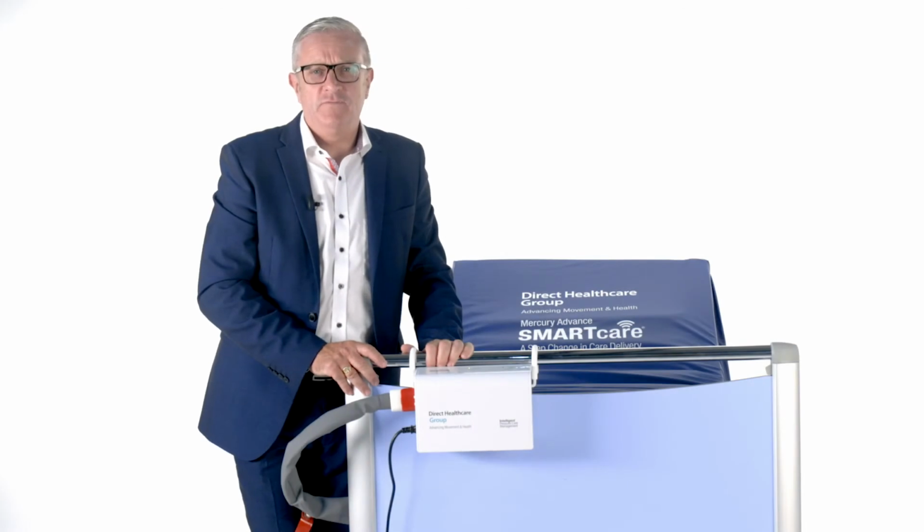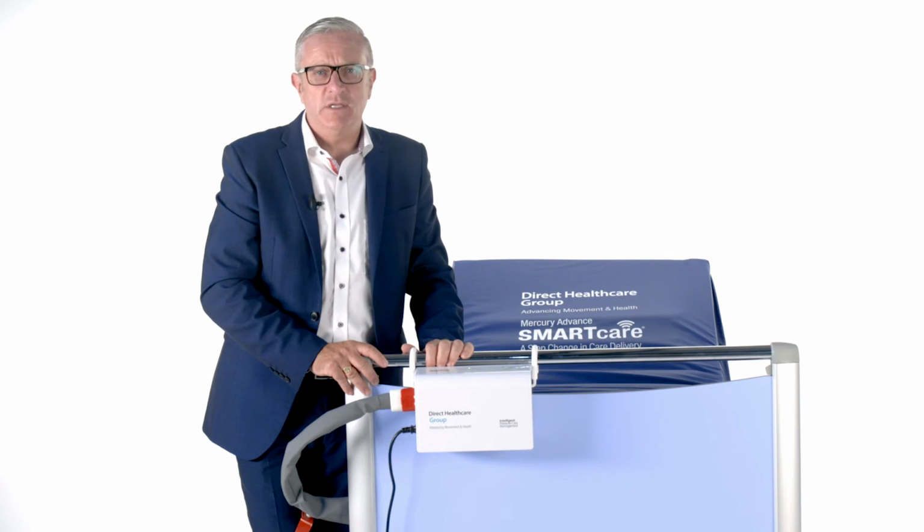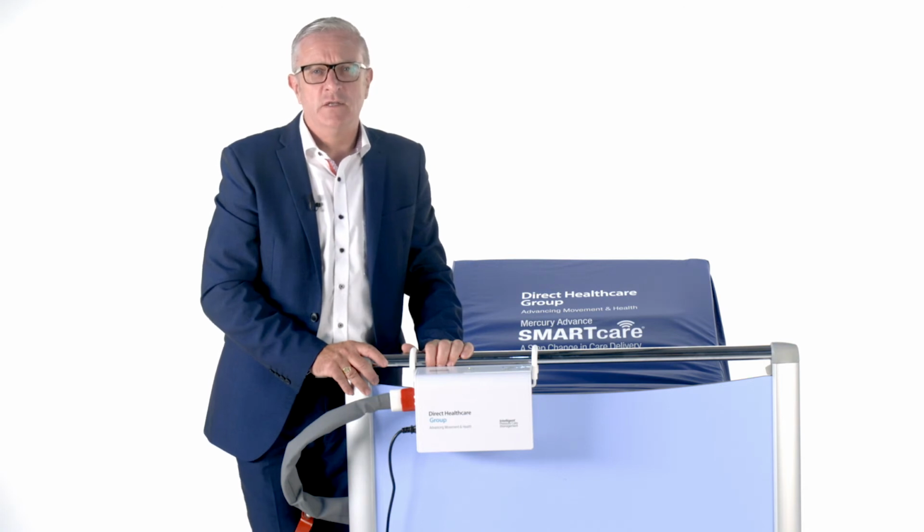The cycle pattern involves 2 minutes of the alternate cell achieving the same pressure as the inflated cell, 2 minutes with the cell deflating and 6 minutes with an inflated and deflated cell. This cycle pattern prevents the user being moved forward to the footing of the bed due to a wave motion.